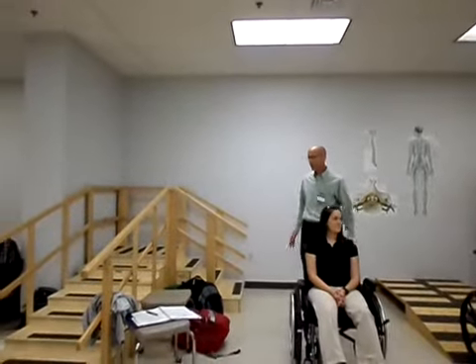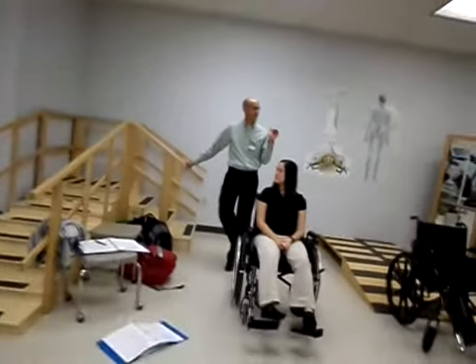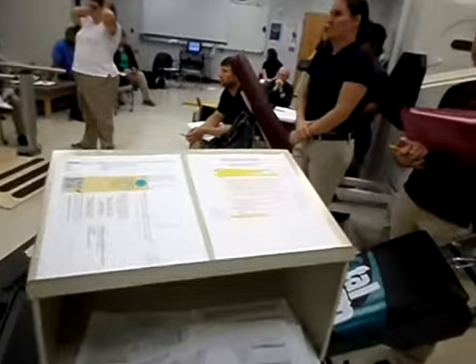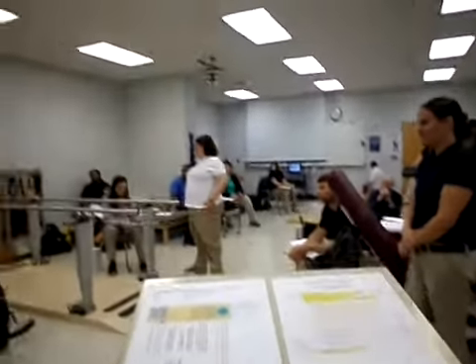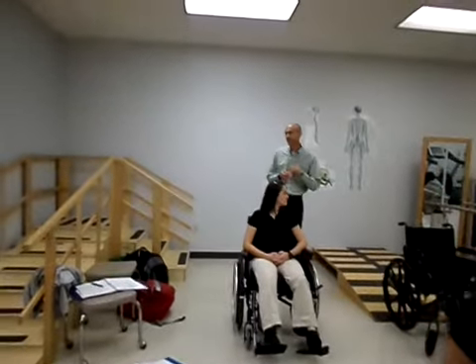Okay, so you want to practice on the curve, going up and down, forward and backwards, both ways. And then you want to practice going up and down the steps, going up which way? Backwards. Going down which way? Forward. Make sure you have 2 people helping when you do that.